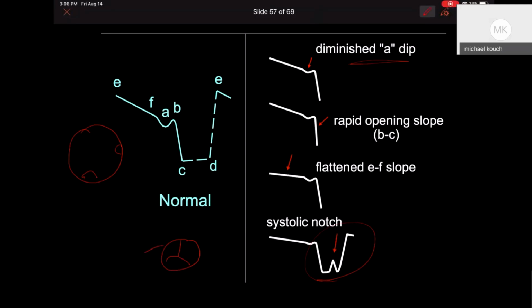On the right side of the screen, we'll start to see our tricuspid valve. And out here, we start to see our right ventricular outflow tract. This area here is our main pulmonary artery. And this is our pulmonic valve. And so basically, we put our M mode across this valve here. Gotcha. Right? So you have to be tilted pretty far up.